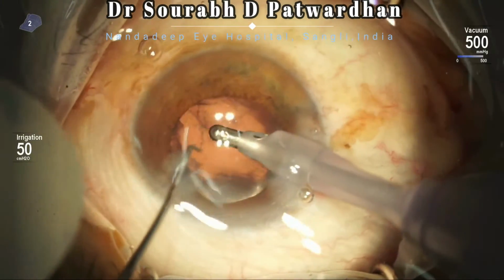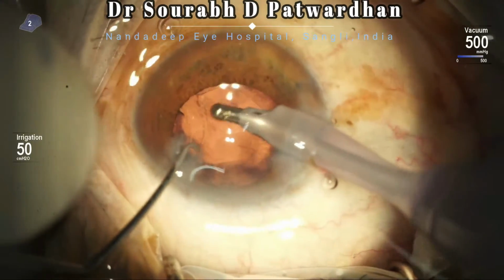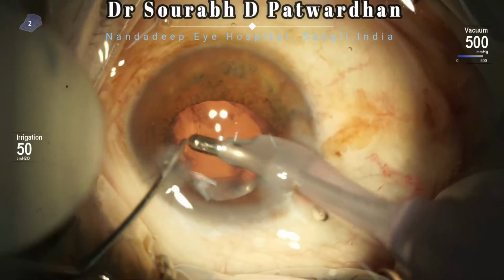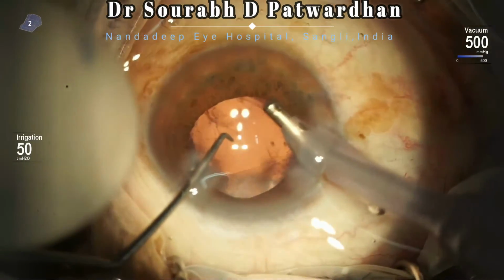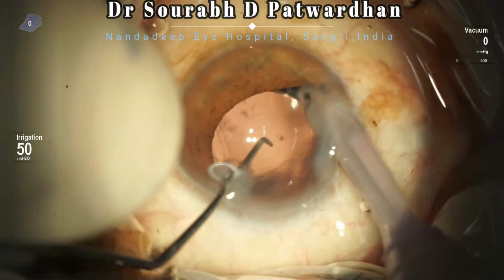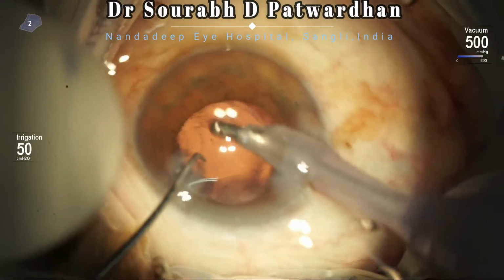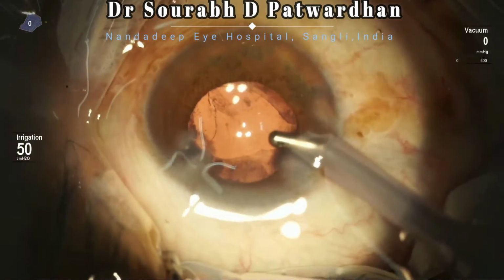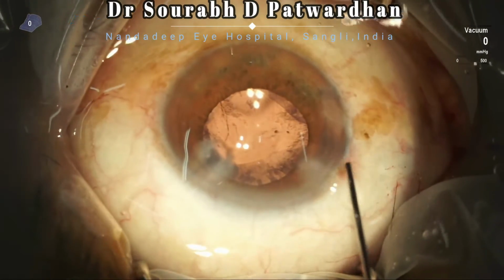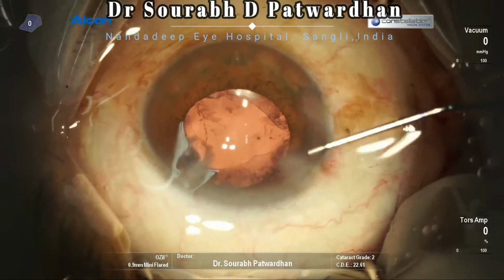Again, for the IA, we have to be very gentle here. Again, look at the pressure, it is just 50 centimeters, and I am trying to wash off all the Viscoat or the Hylucoat which I have placed. It is important to wash it out, because it is a high molecular weight viscodispersive agent, and it has to be aspirated out, otherwise it may cause raised IOP. Here I wished to go behind the IOL and wash off some of the visco there, but because the capsule is already torn, I don't want to take that risk. The rest of the little bit of visco in the bag will definitely come out and get absorbed, because the capsule is already torn and there are spaces around the IOL to come out.